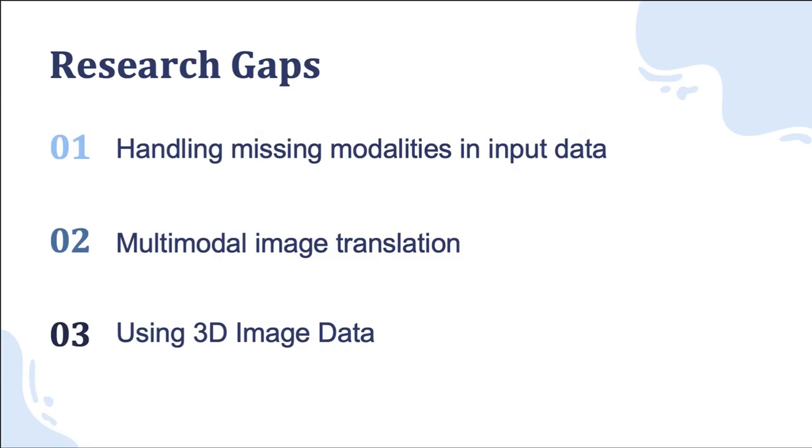Therefore, we have discussed the following research gaps from the related works. Firstly, existing models are unable to handle missing modalities in input data, and are unable to carry out multimodal image translation and use 3D image data simultaneously.